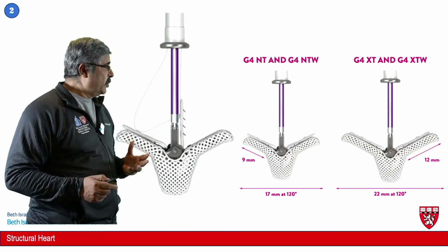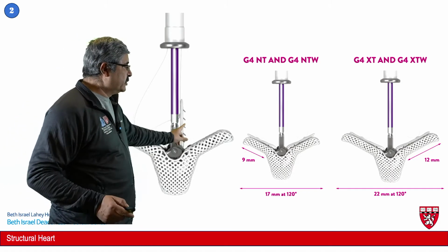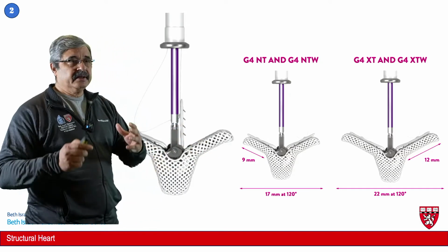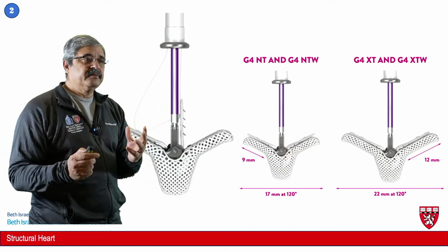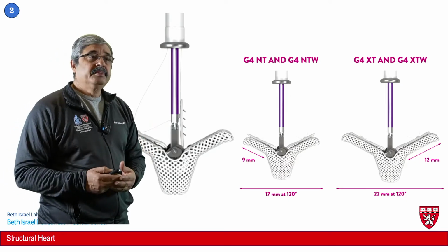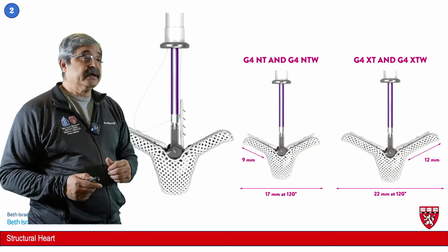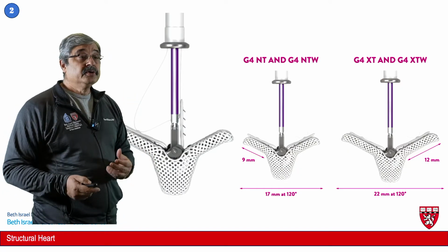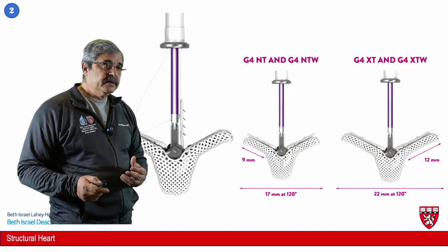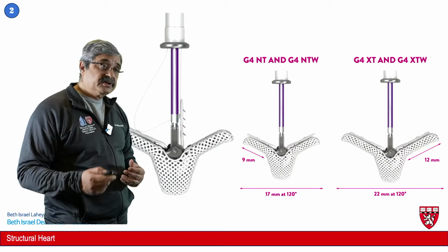However, one of the most important technological advances was the ability to grasp each leaflet separately, because the prior generation of mitral clips had a design where both leaflets were grasped simultaneously and then brought together, which was sort of a problem with patients who had arrhythmias, patients who were tachycardic, and you had to time it absolutely correctly, and sometimes even use adenosine to induce a transient cardiac arrest to grab the leaflets. However, the ability to grasp them individually has done kind of wonders, and we do some complicated, challenging cases also.